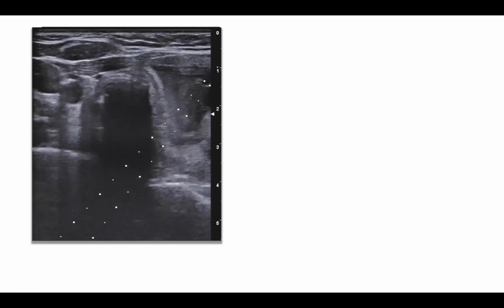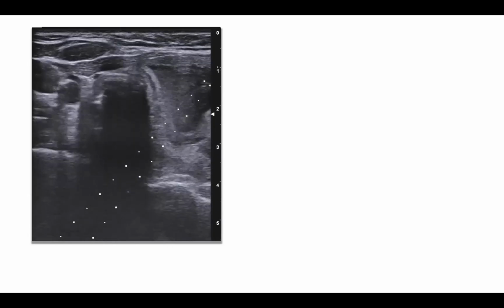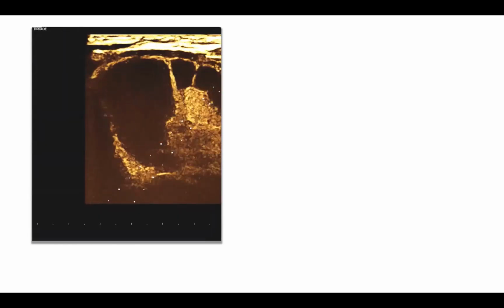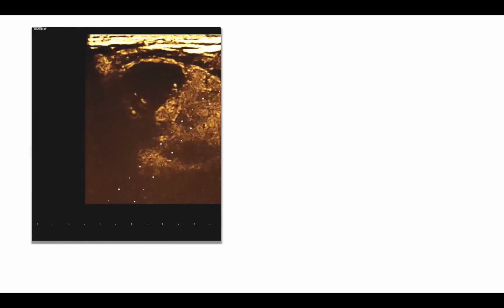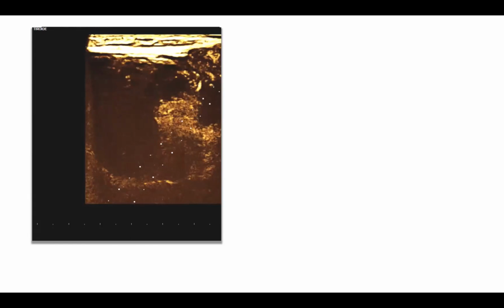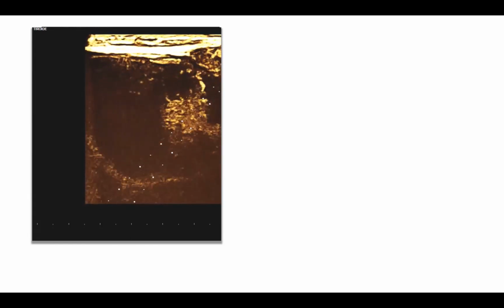At that point, we decided to stop the aspiration of fluid and perform the treatment directly. As you can see here, a few seconds after the aspiration, most of the fluid reformed completely, occupying most of the nodule.